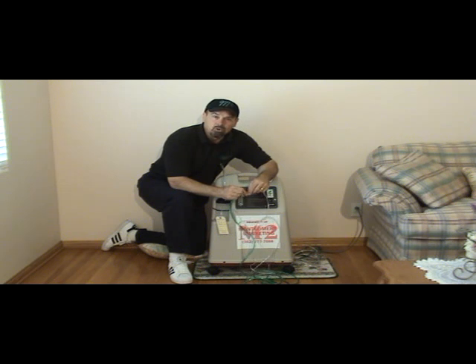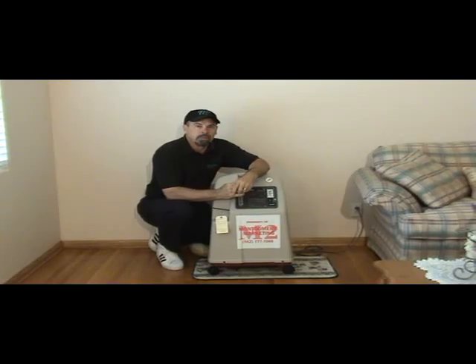Next thing that we'll go over with these units are other safety issues. Okay, just a couple things to remind you of when you're dealing with oxygen in a home. Number one, oxygen should never be placed around a heat source, an extensive heat source. Oxygen itself is not flammable, but it will make a flame a lot higher. So you want to keep it away from stoves or fireplaces or anything like that.